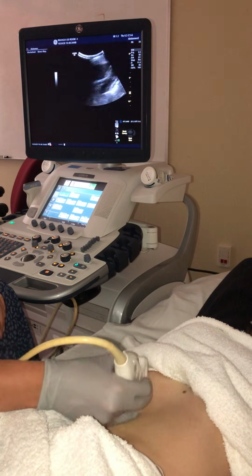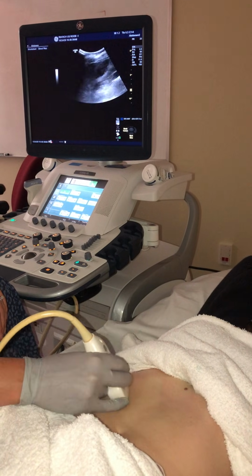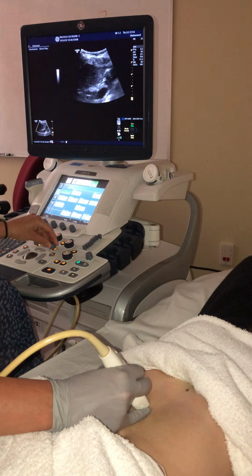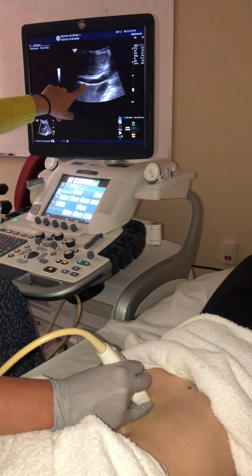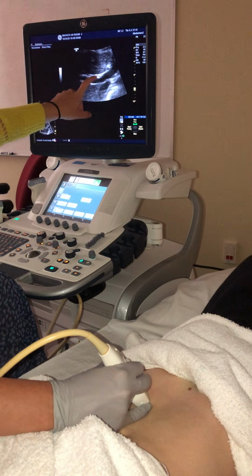Just adjusting my settings here. We have our portal vein coming into the liver, sitting parallel, right on top, common bile duct.